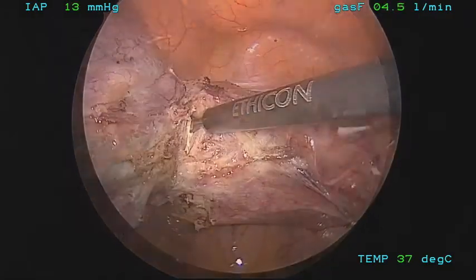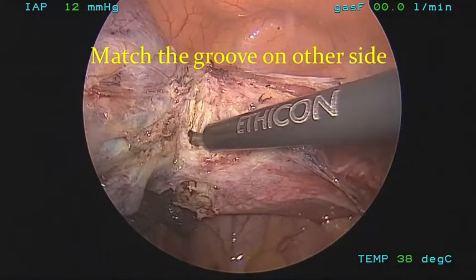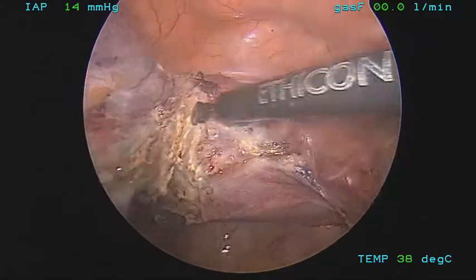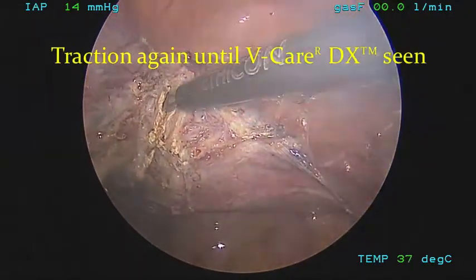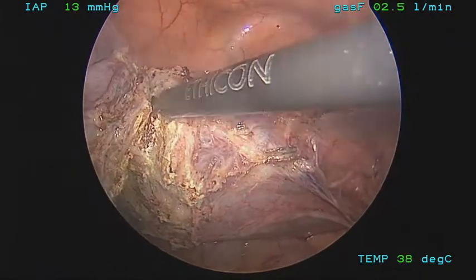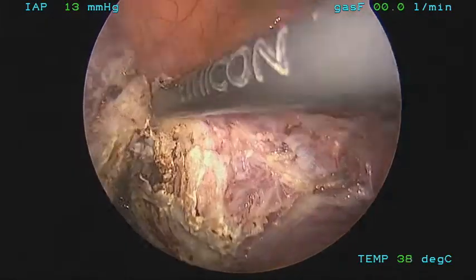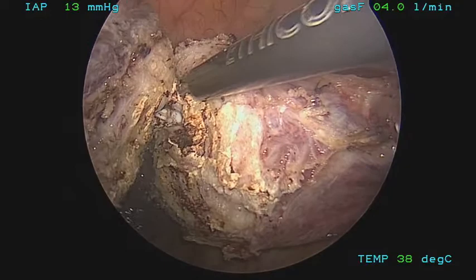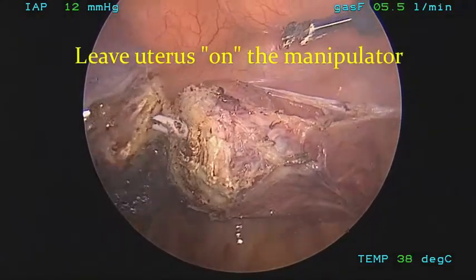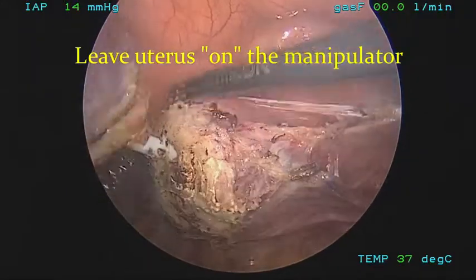Now the manipulator can be visualized, and transection continues from the opposite side. Care is taken to make sure that you stay in the same track in order to prevent the staircase effect. Once the cervix is separated, we like to leave the uterus on the manipulator until the pouch is brought in. Now complete separation occurs.